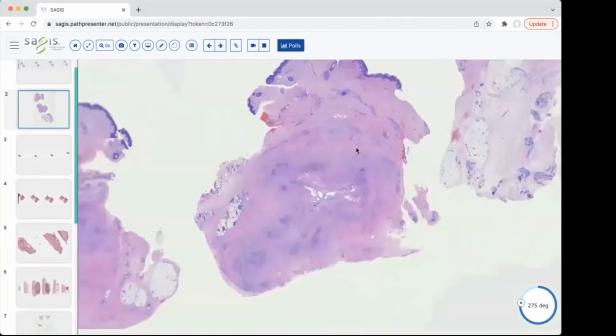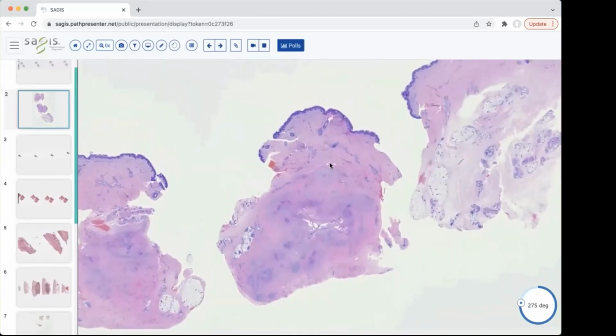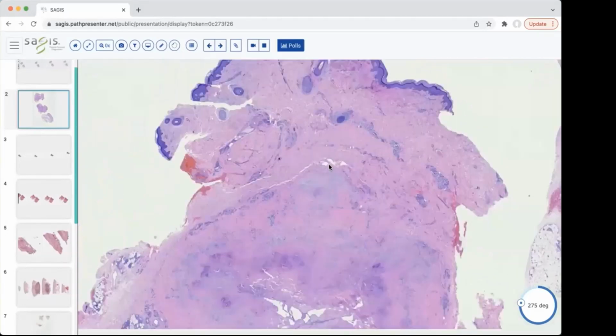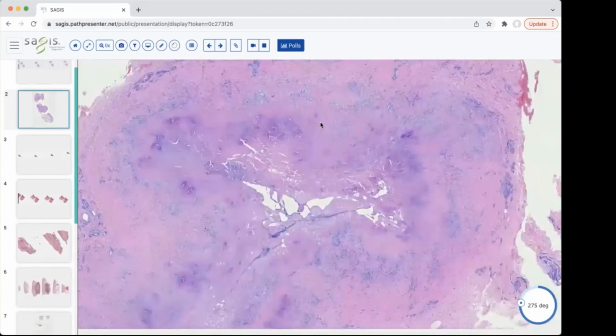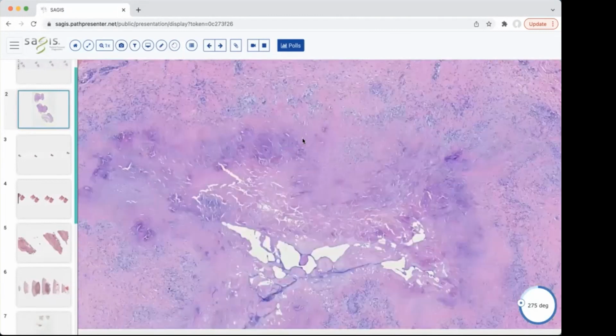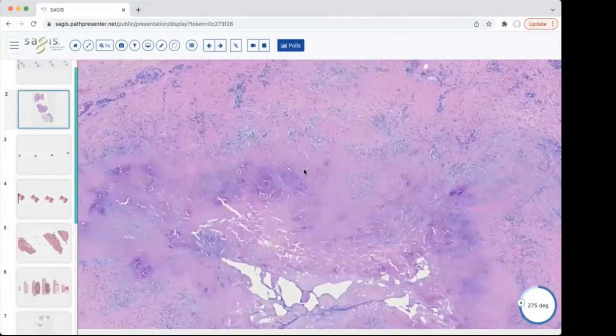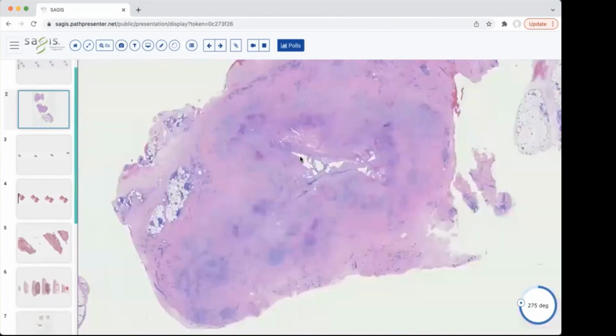These are generally in the deep subcutis or deep dermis and subcutis as well. You don't generally get these higher up, but there are cases that do that. Sometimes patients with quote unquote rheumatoid nodule won't have rheumatoid arthritis. In that case, we call them pseudo-rheumatoid nodule. And there is some overlap with what they call deep GA, deep granuloma annulare, but this is a really good example of a rheumatoid nodule.